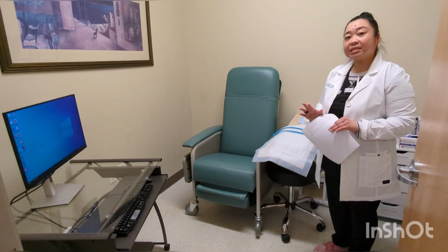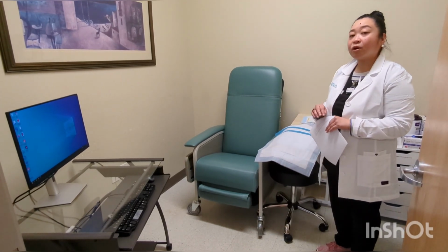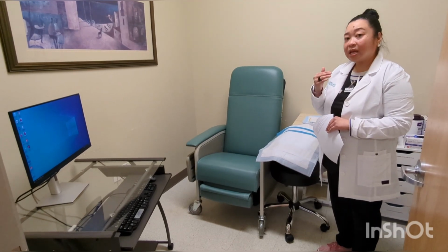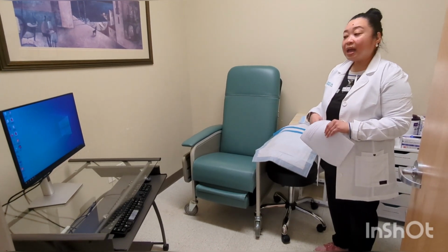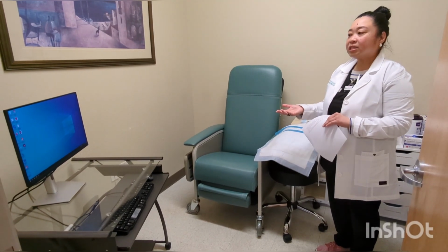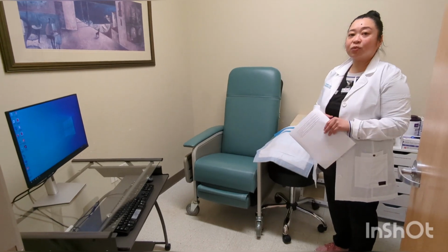2 to 3 minutes into that, I come in and give the patient, through the IV, the radiopharmaceutical that will track the blood flow and activity in the brain while they're being stimulated. Soon after, I will also remove the IV, then leave the room and have them finish. After 14 minutes, the computer will stop, and then we can proceed with the scan.